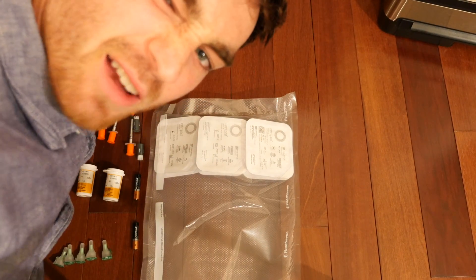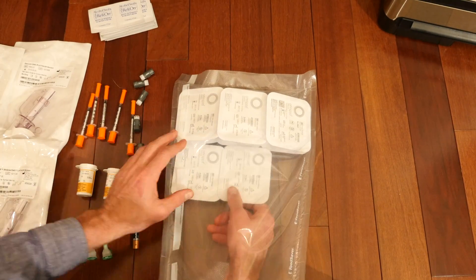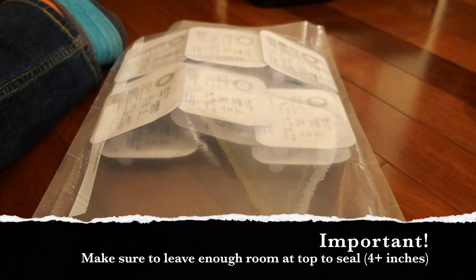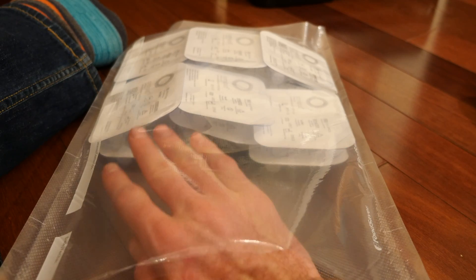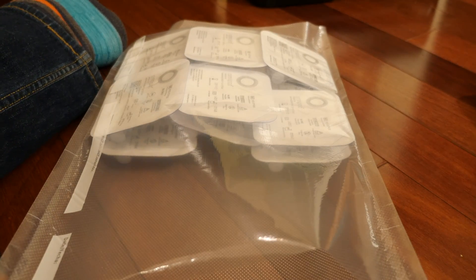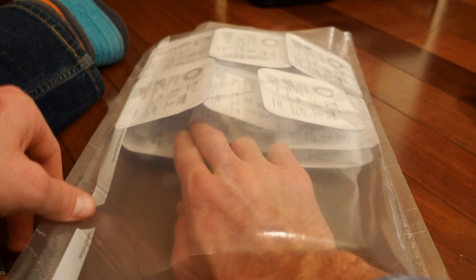Sometimes they don't want to cooperate — you've got to kind of finagle them a little bit. Right now we've got 12 pods in, but as you can see we've got a little bit of extra space here and there, so we're gonna squeeze a couple more pods in and do a couple rows of three.